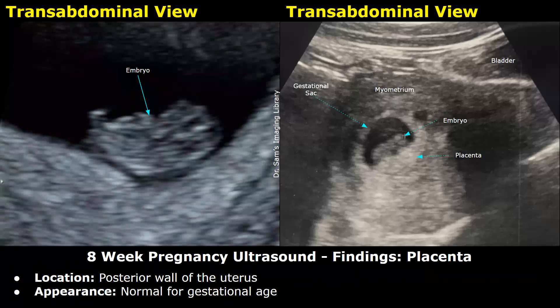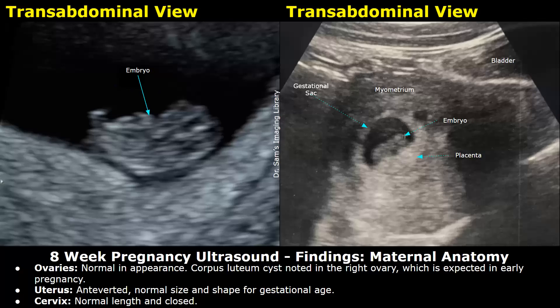At eight weeks you can see the placenta in this image. It appears as a hyperechoic thick structure along the gestational sac wall. The location in this example was the posterior wall of the uterus. The appearance is normal.